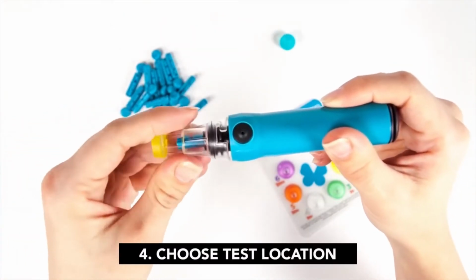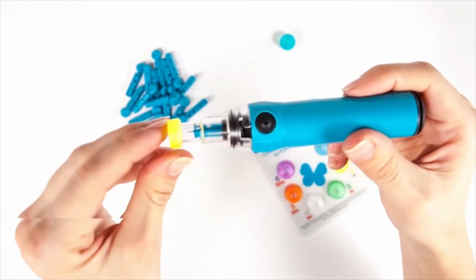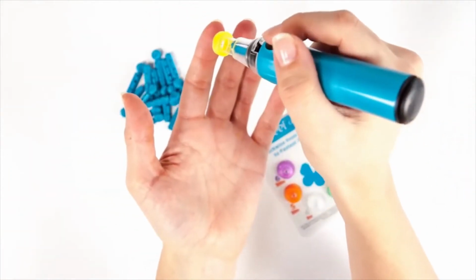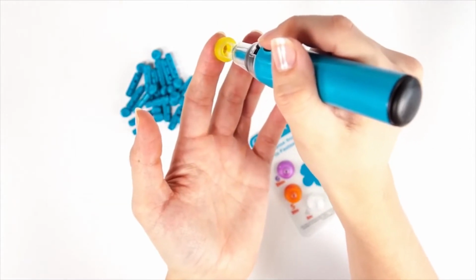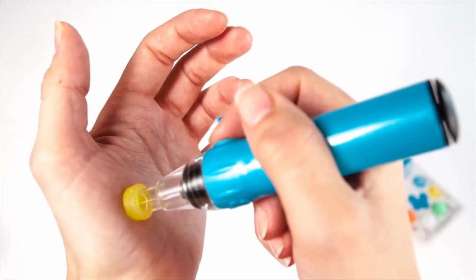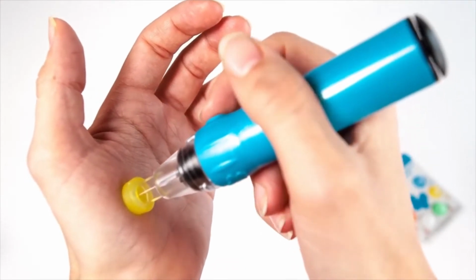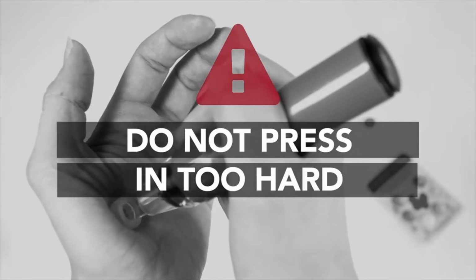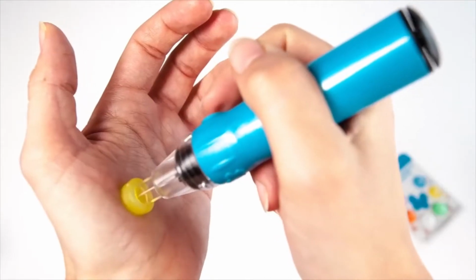Choose a test location without much body hair and with enough surface area to cover the contact tip's width to create a tight seal. We recommend your fingers or palm. If a seal cannot be made, Genteel will not function properly. Keep Genteel flush with the surface of your skin, but do not push in too hard. Use just enough pressure to maintain a seal.